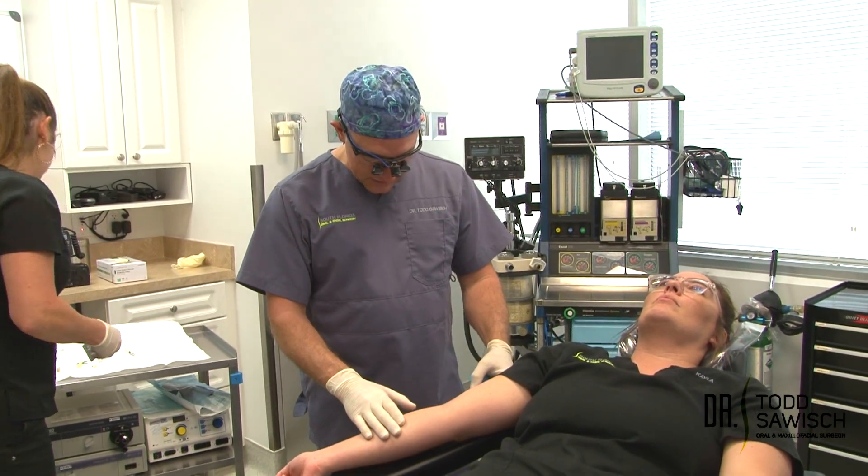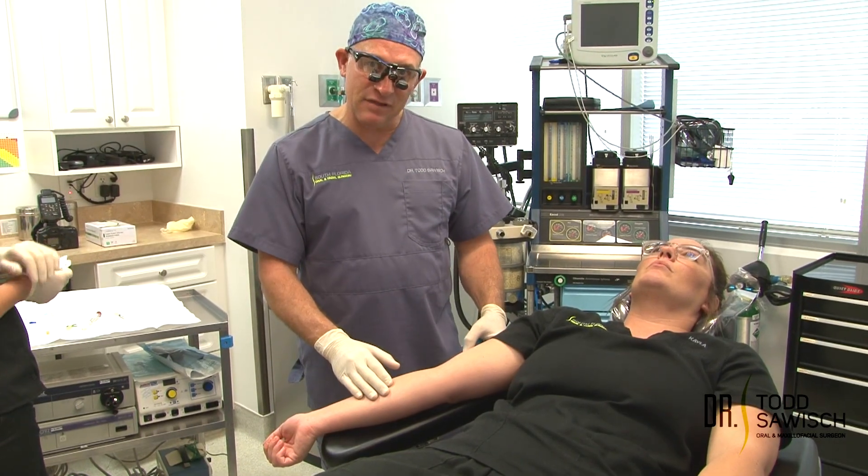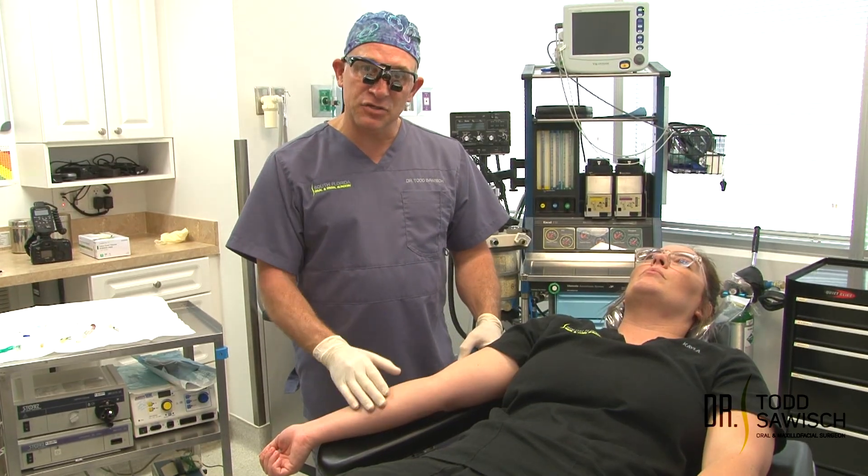The advantages of a butterfly needle is it's a 21 gauge needle, it also has an extension on it, it's easier to see the flashback, and then we're going to draw it up into a vacutainer tube so we can spin down our blood.